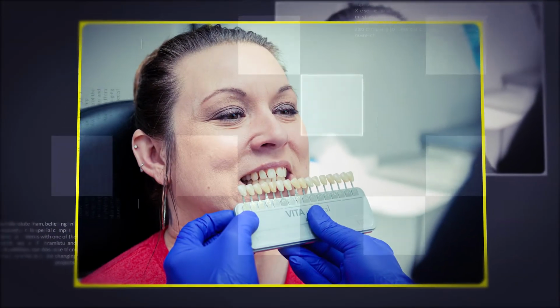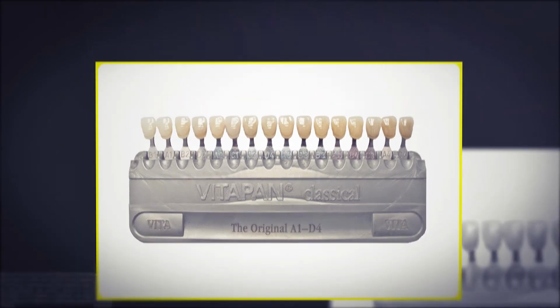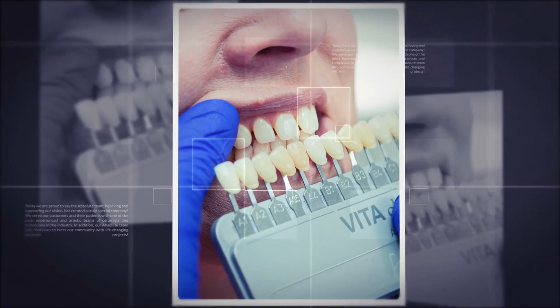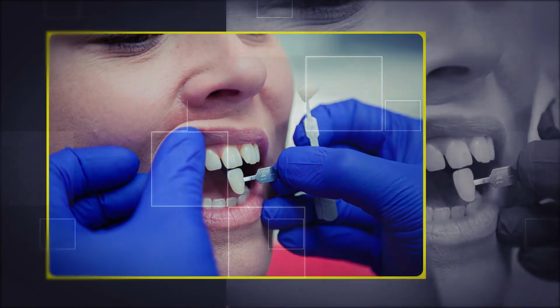Take the shade as soon as the patient gets to the office, before their teeth dehydrate. Rearrange your shade guide to a value shade guide. Hold the shade tab incisal edge to incisal edge and have the patient open their mouth to create a uniform background. Remember to always take the shade tab picture with the shade ID in frame.